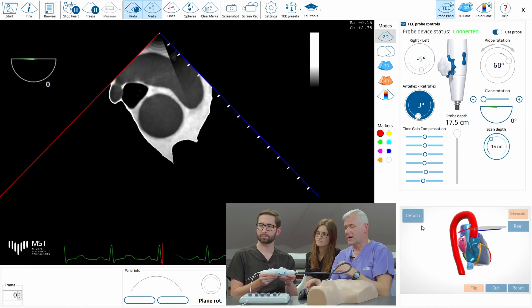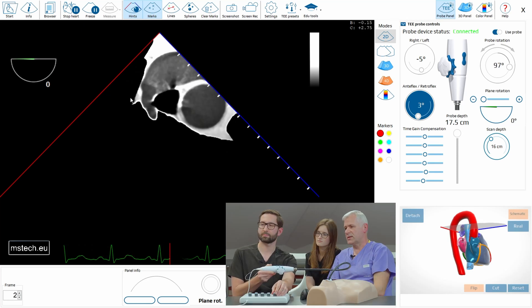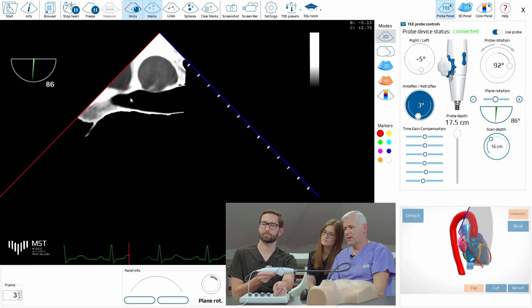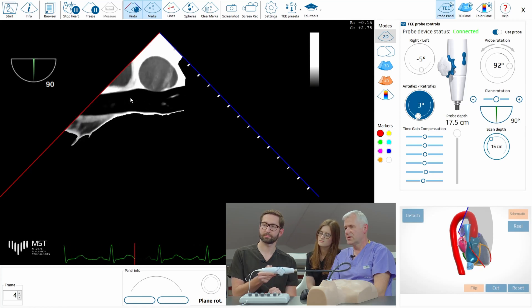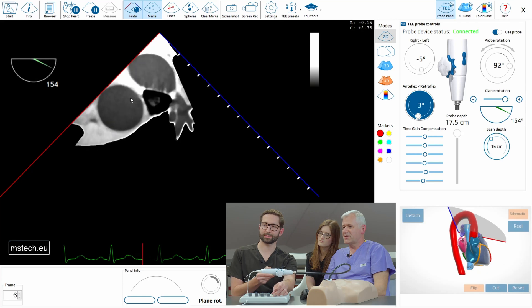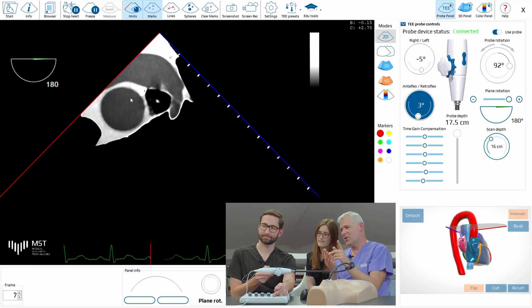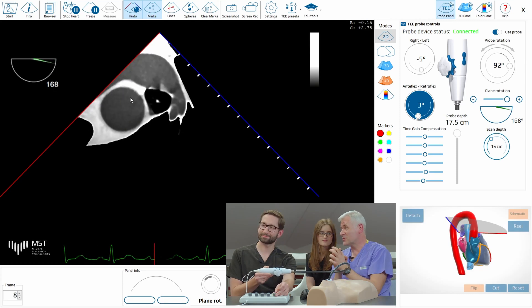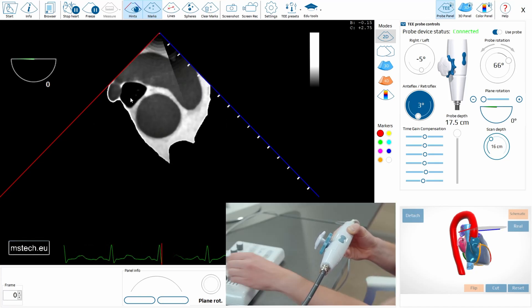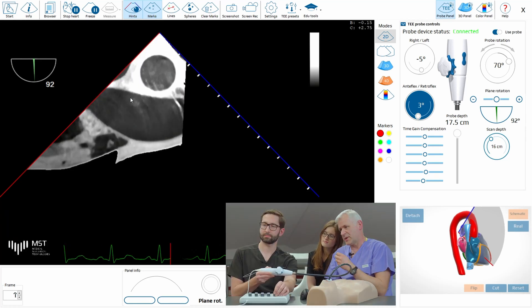For example, move the superior vena cava — this one here — to the center. Now change the angle to 90, keeping the vena cava in the center. You see the longitudinal view of the vena cava. For the short axis, come back to zero — or you could go to 180, but then the aorta is on the left side, which is a mirror image, so always avoid angles close to 180 as it will cause confusion. Come back to zero and you'll see the vena cava again. Now position the aorta in the center and go to 90 — you should see it in longitudinal view.